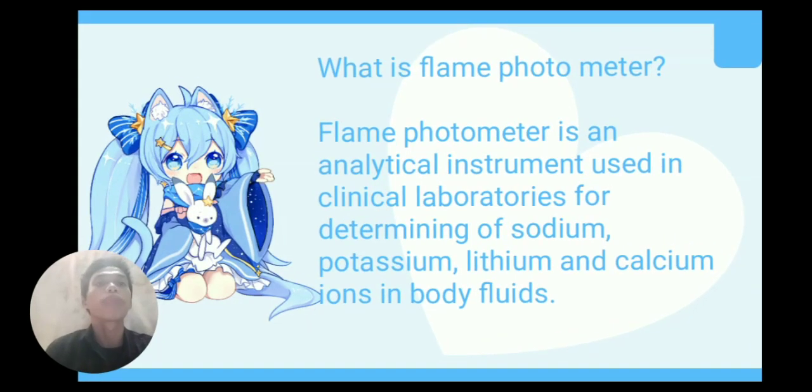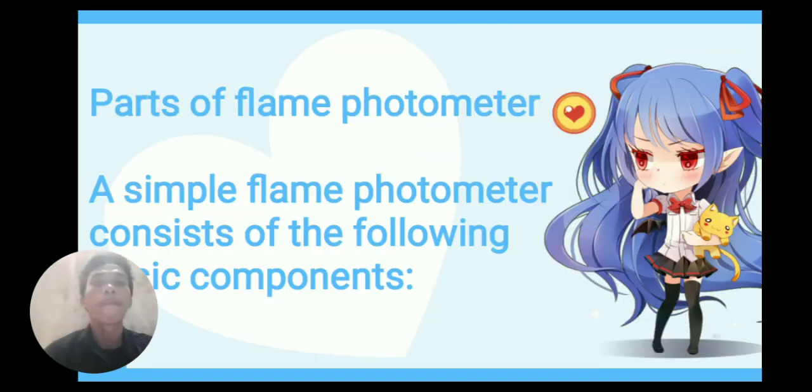What is flame photometer? Flame photometer is an analytical instrument used in clinical laboratories for determining of sodium, potassium, lithium, calcium ions in body fluids. Parts of flame photometer. Simple flame photometer consists of the following basic components.